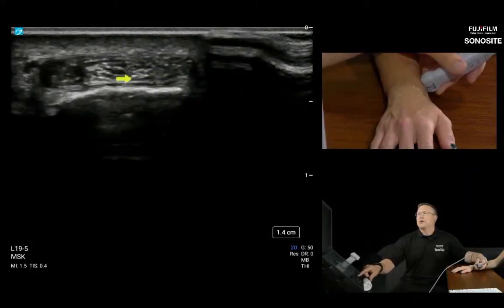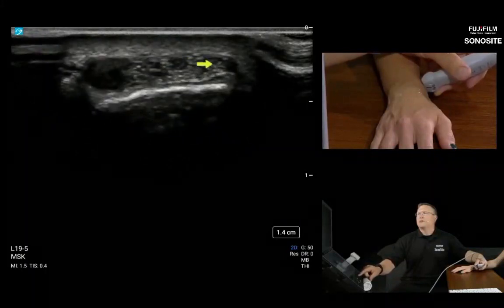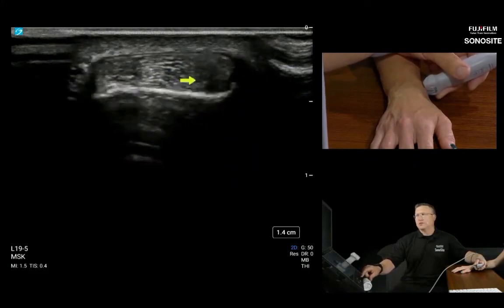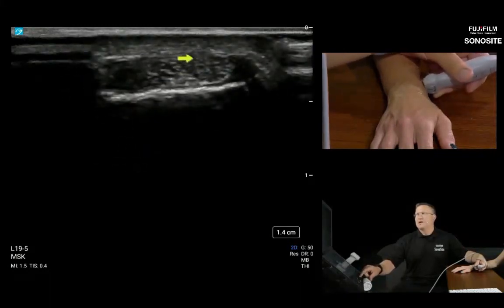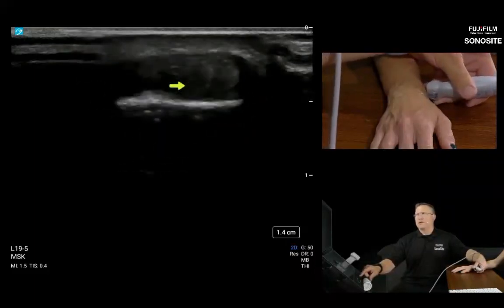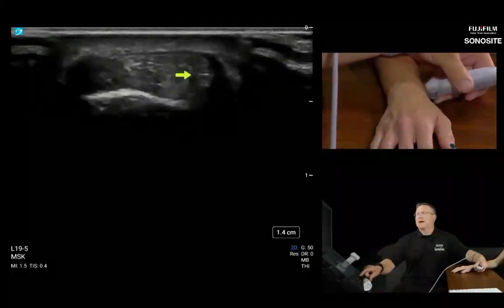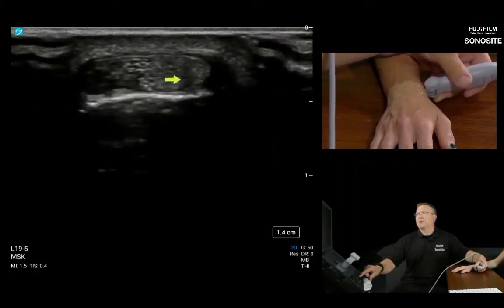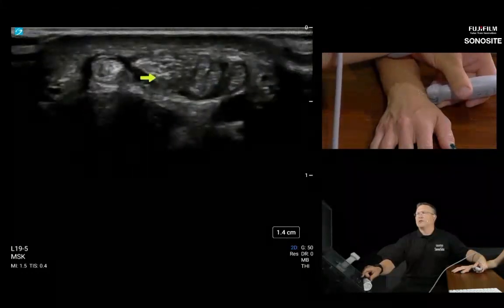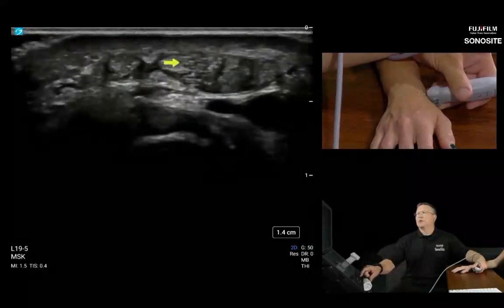Now, APL is normal in this case, but in some cases it can comprise multiple tendinous slips, and we don't want to call those pathology. In some people, this tendon can already show itself as a group of splitting tendon slips. As I go distal, you actually see those, but at the level of the retinaculum in some of the patient population, you can already see the vertical slips. So here's one, here's one, here's one, there.